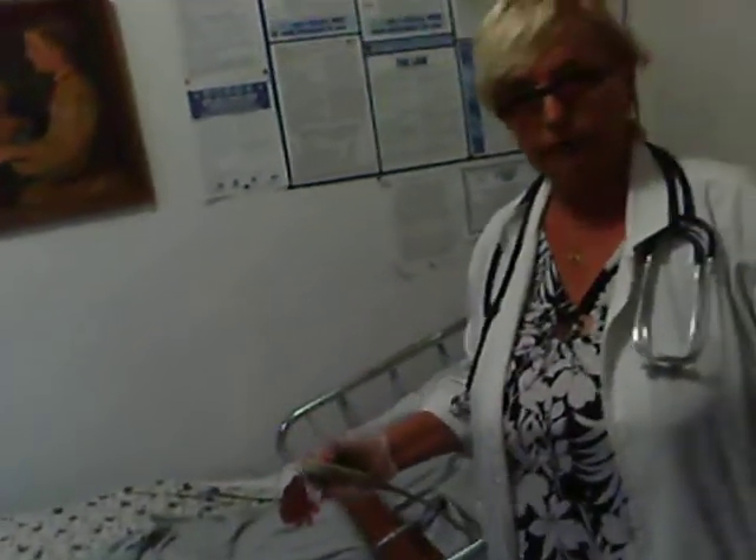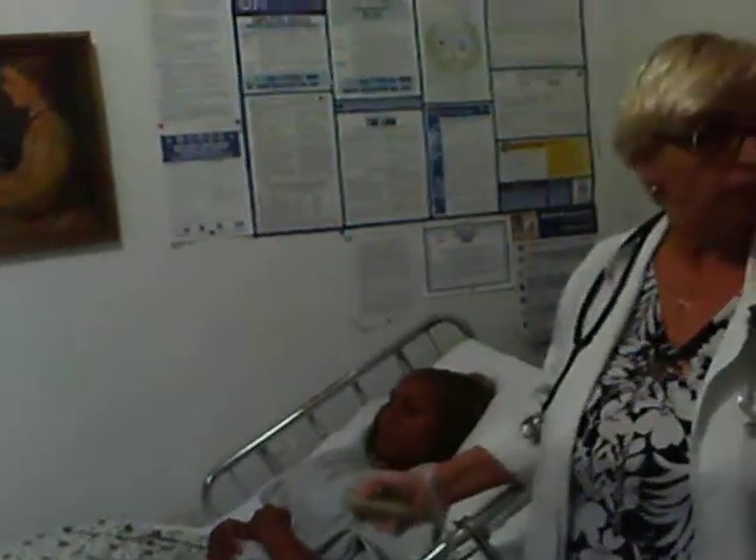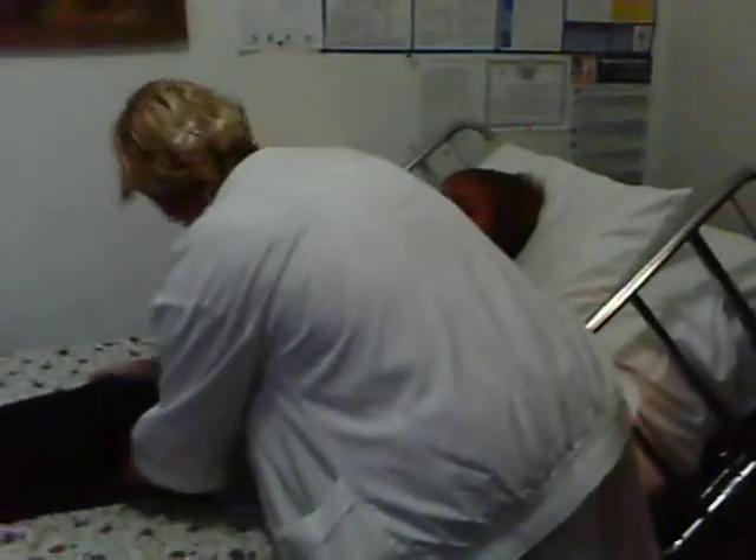I am going to raise the patient's head up, because it is much easier to get the patient up from the bed. Okay, Mrs. Green, would you please help me with your feet down? Let me help you here. I say one, two, three. Can you hold the bed for me? Can you scoot down a little bit, please, until you reach the floor? Are you okay? Yes.